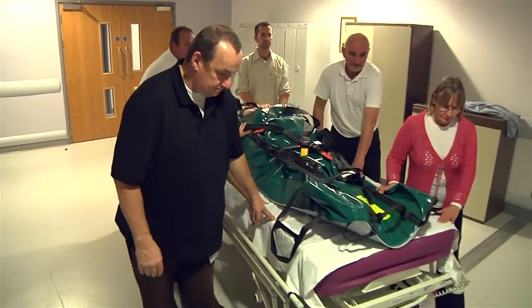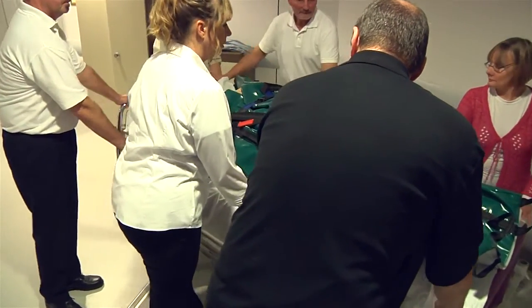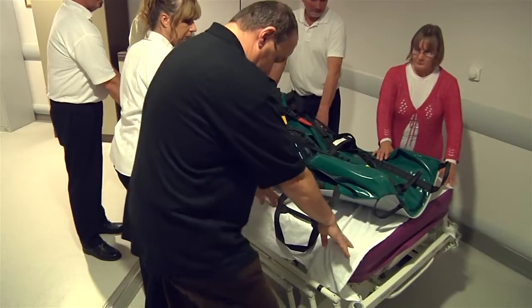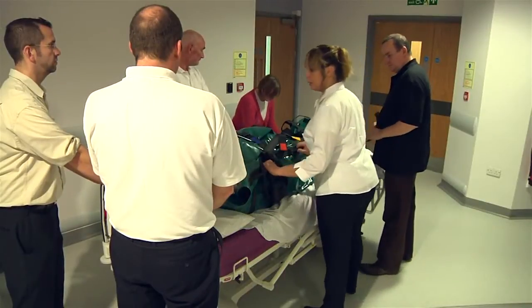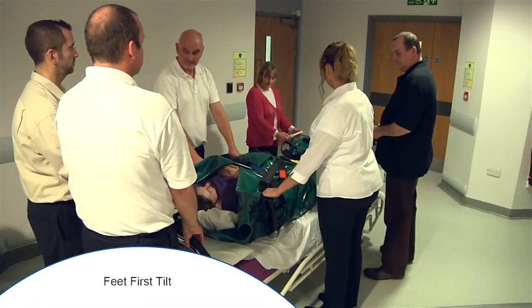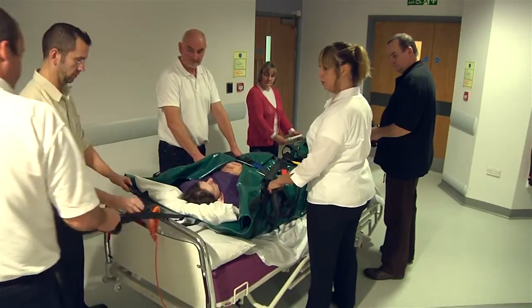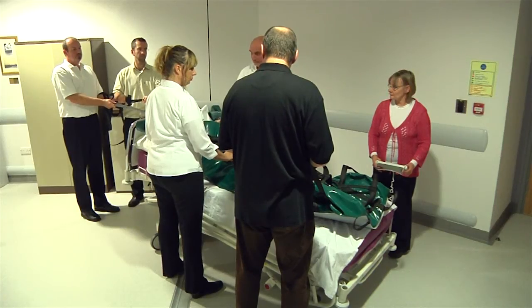Your individual personal evacuation plan must be adhered to in the safe movement of patients down the stairs. For further guidance, contact your organisation's moving and handling department. It is important that all operators carrying out the evacuation closely follow the instructions of the lead person so that everybody pulls and moves at the same time. Remove the foot end of the bed, lower and tilt the bed.